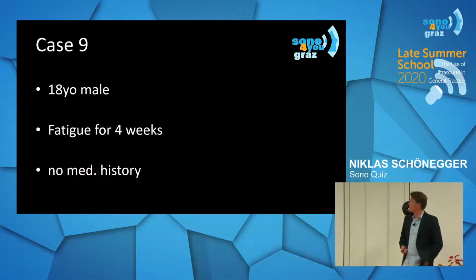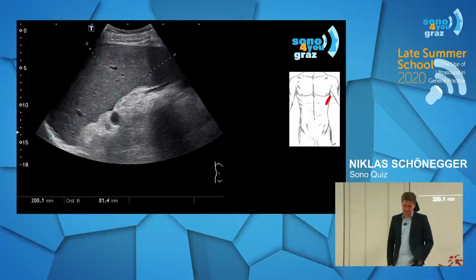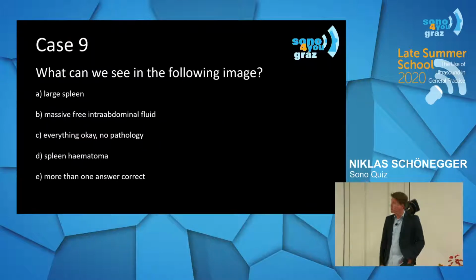So the last case is an 18-year-old male patient who also presented to you with fatigue. You know him because he's a football player in your town, and you check him with sonography. His heart and his lungs were okay, and you made an abdominal ultrasound and found this.